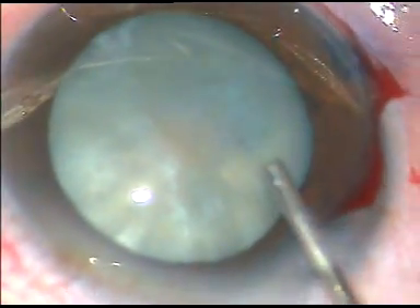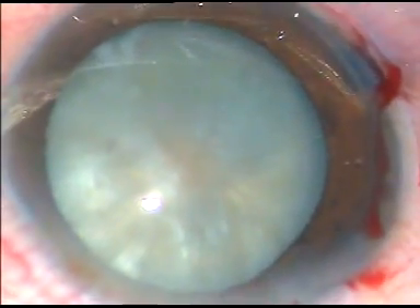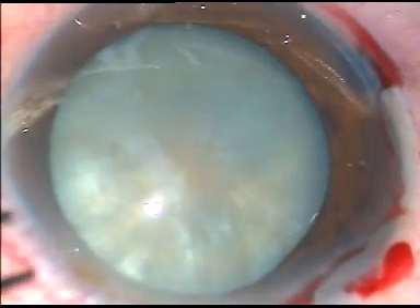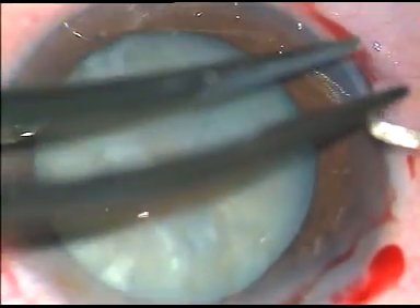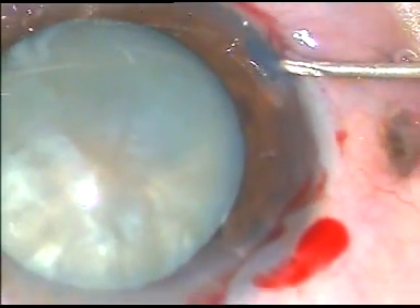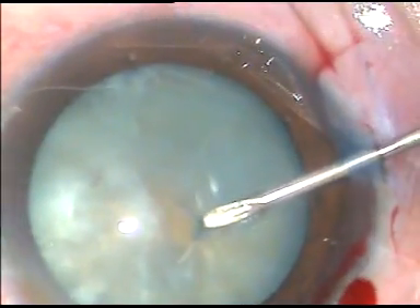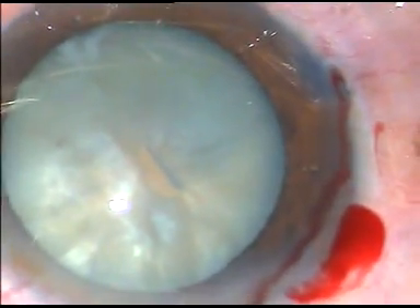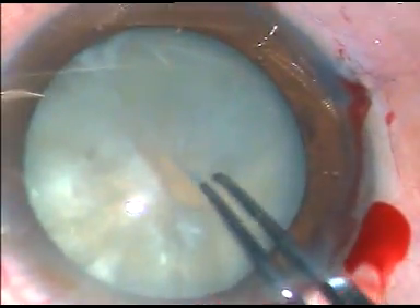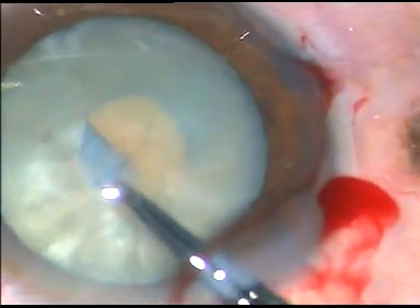It means there is some intumescence in this case. This viscoelastic substance being used is not a cohesive viscoelastic; it is just HPMC. Now, the anterior capsule is incised right at the center. In this case, no oily fluid came out, but there is a lot of convexity of the anterior capsule.